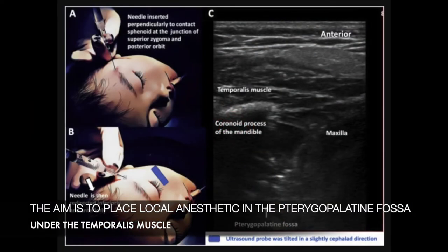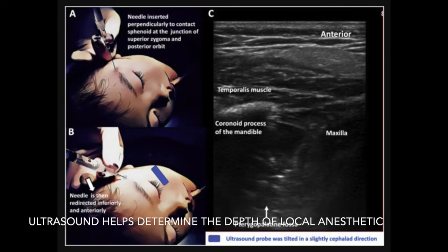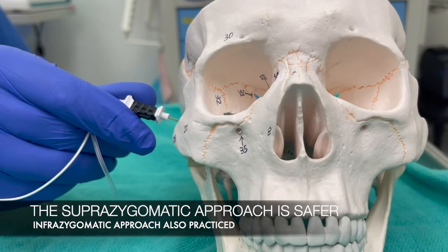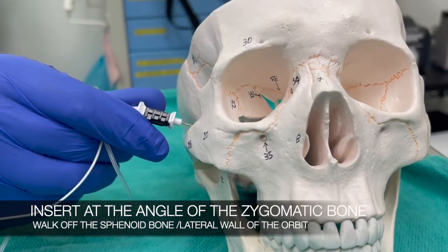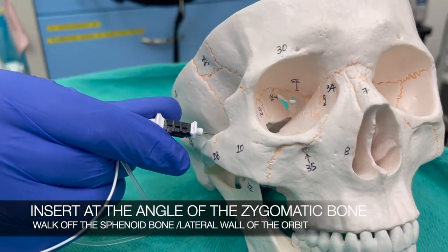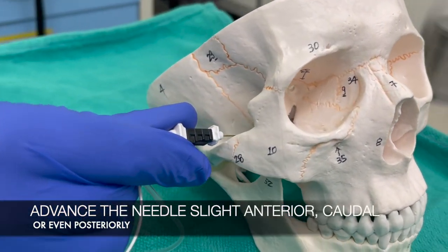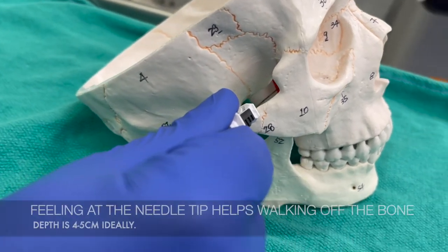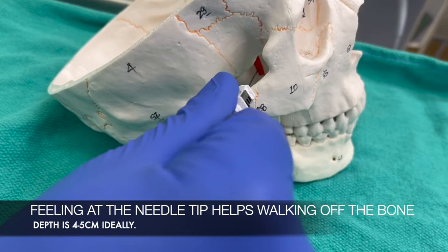In this nerve block, local anesthetic is placed in the pterygopalatine fossa. Ultrasound helps determine the depth of local anesthetic. The block needle is rarely seen in this out-of-plane ultrasound technique. The suprazygomatic approach is a safe technique. Insert the block needle at the angle of the zygomatic bone, walk off the sphenoid bone, and advance the needle slightly anterior and caudal. The needle tip can be advanced to four to five centimeters.